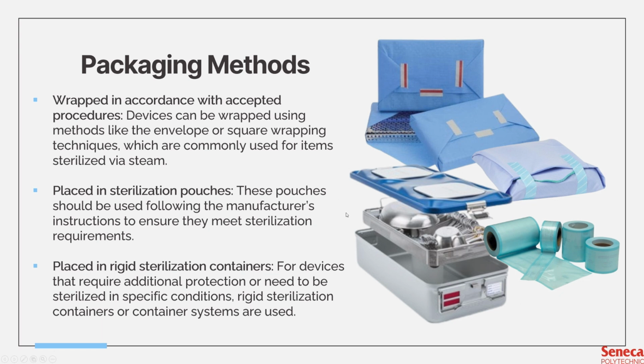If we were to use an example such as labor and delivery, as all of you should know, labor and delivery is considered an emergency procedure because women cannot choose when they'll give birth. It kind of just happens whenever the baby wants to come out. So we have a bunch of sets in here for L&D, just so that it's easier for the nurses or doctor to access it without having to open several sets, right? So everything they need to deliver a baby safely would be in the set.